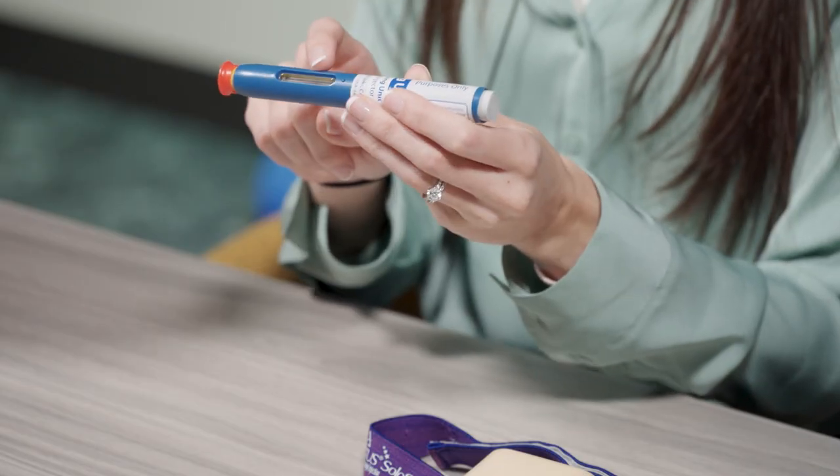When you're ready to inject, remove the auto-injector from the refrigerator and wait at least 30 minutes to reach room temperature. This is important for administering the entire dose and minimizes discomfort. Do not attempt to heat the pen. Ensure the medicine in the window is clear and colorless to a slightly yellow color.